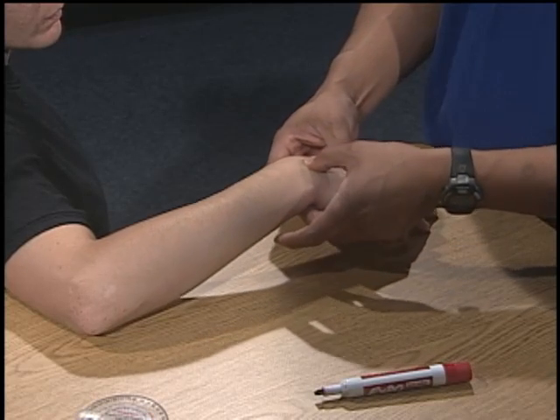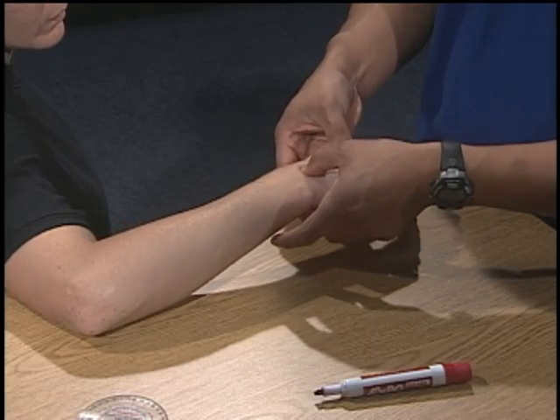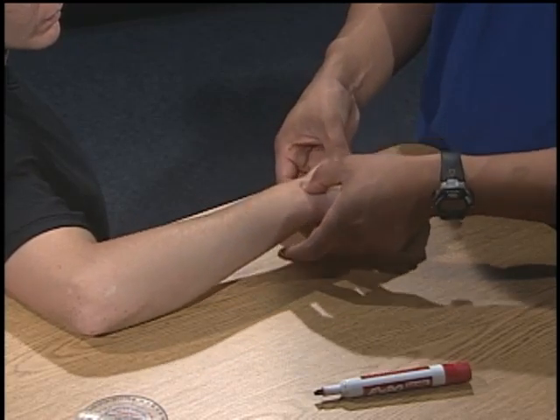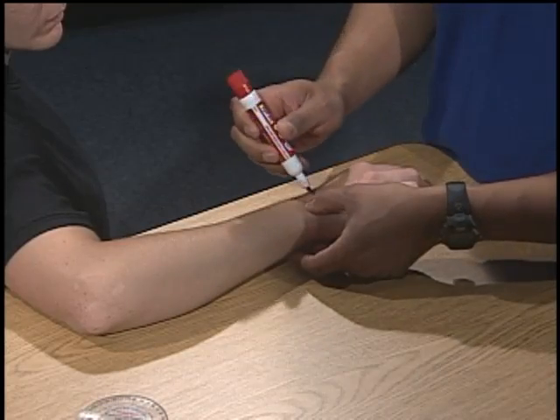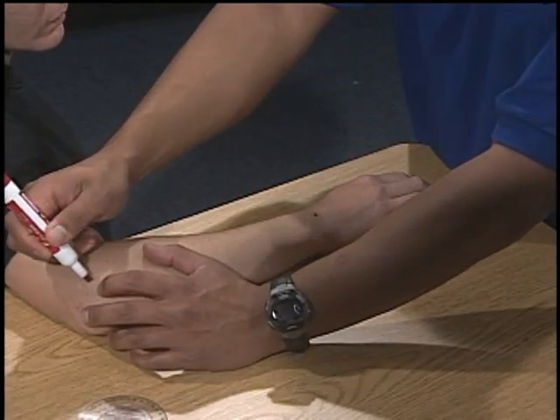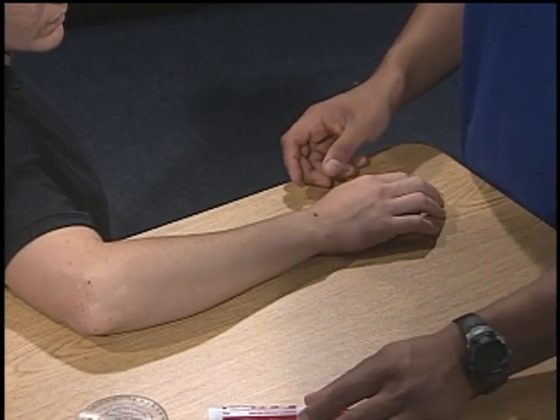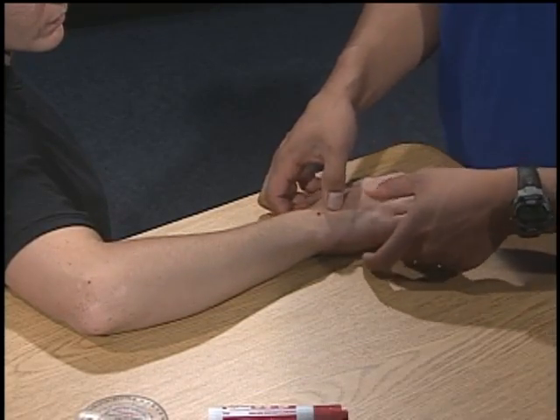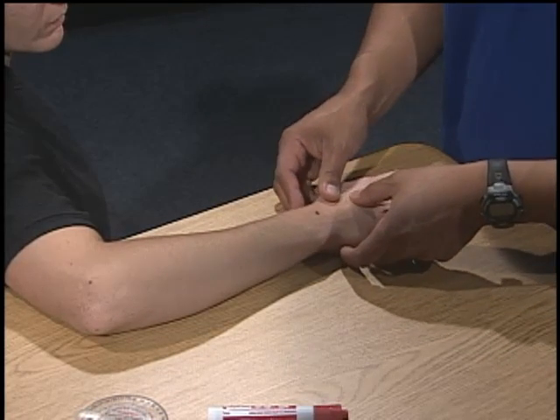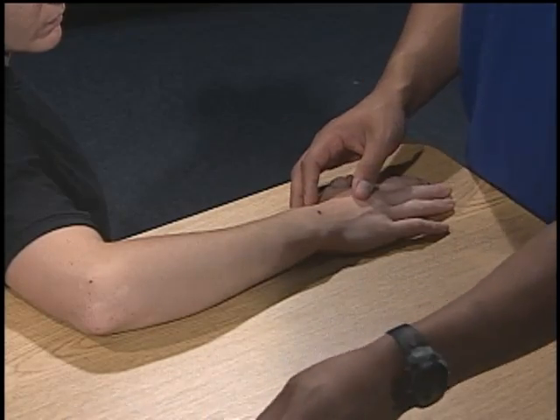You are now ready to measure the joint range of motion. Make sure you expose the bony landmarks you will be using. The size of a smaller plastic goniometer will make this measurement easier. Align the axis of the goniometer on the dorsal aspect of the wrist over the capitate. Align the stationary arm with the dorsal midline of the forearm using the lateral epicondyle for reference. Align the movable arm with the dorsal midline of the third metacarpal. Do not use the third phalanx for reference.